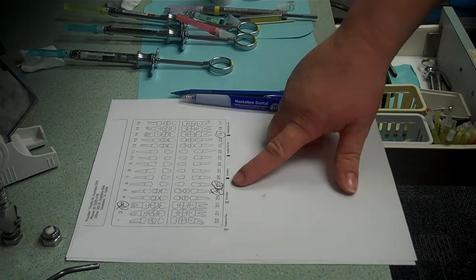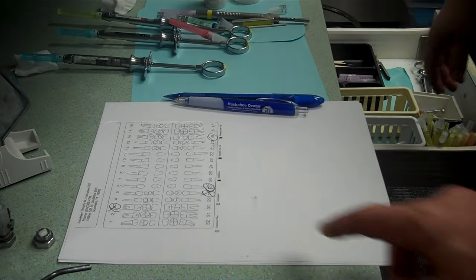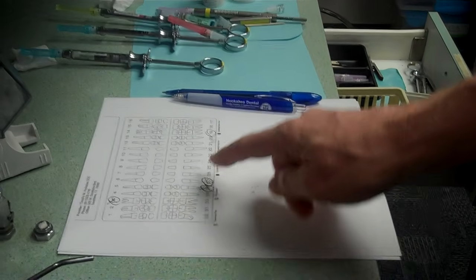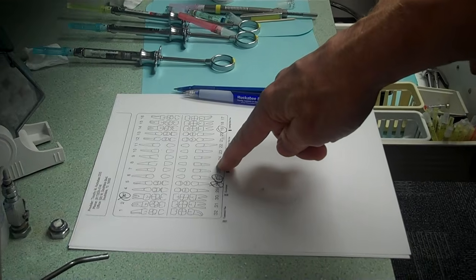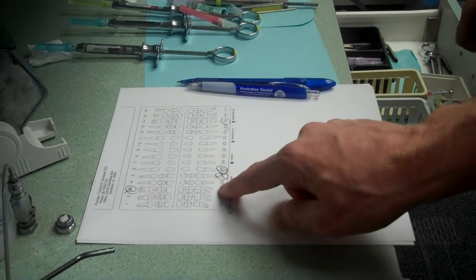Right by it, right at the apex of 27. You'd give it at the apex of 29. 29. Because this is where the mandibular canal is. So you don't want to inject right here on the tooth because the canal's not there. You inject there and it goes forward to the midway point. Okay. If that makes sense.